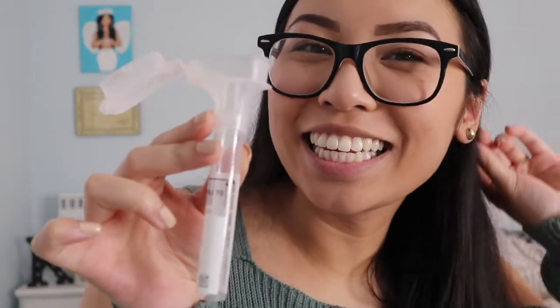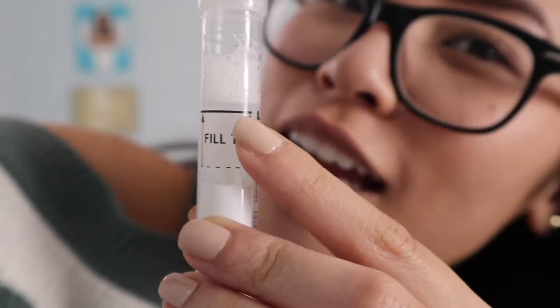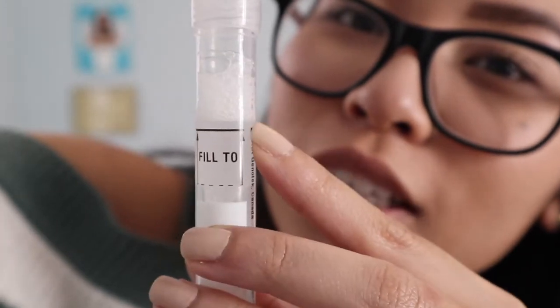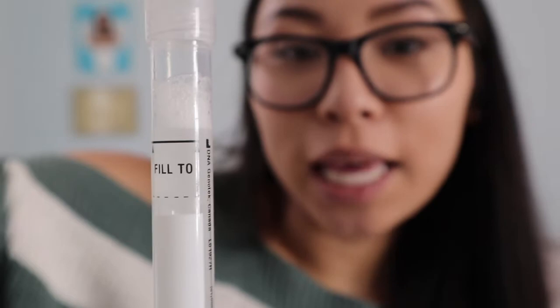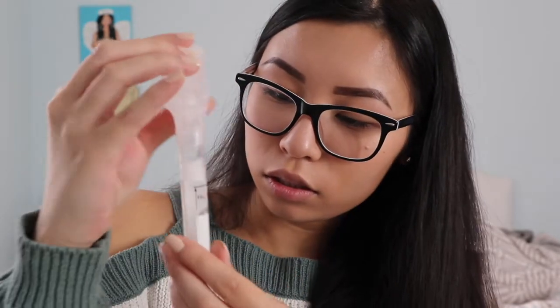Here's a little funnel thing that I'll be spitting in. So far you're supposed to fill it to this line, and I got it to that line, but then there's so many bubbles up here and you're not supposed to have bubbles. The saliva needs to be liquid, not bubbles, but they're gonna get both. Then it says shut this and then close it slowly until it shuts.